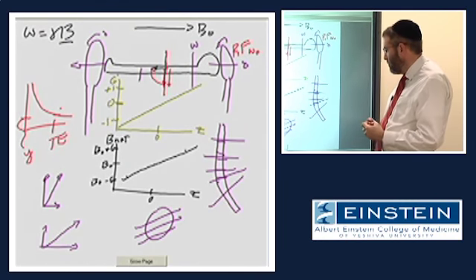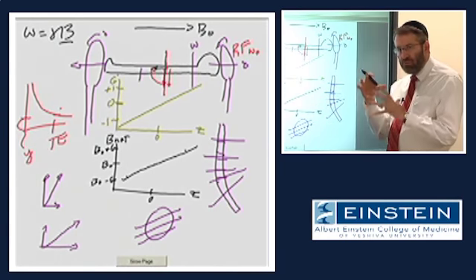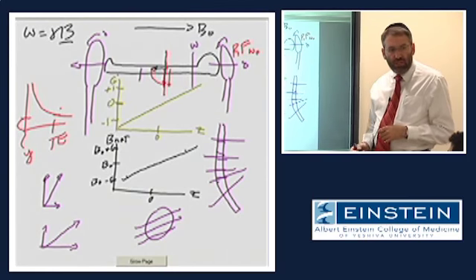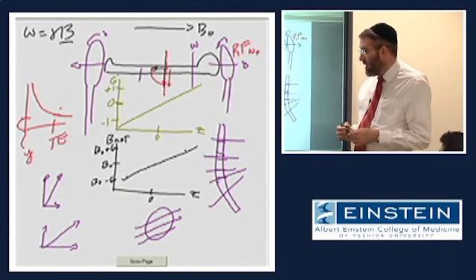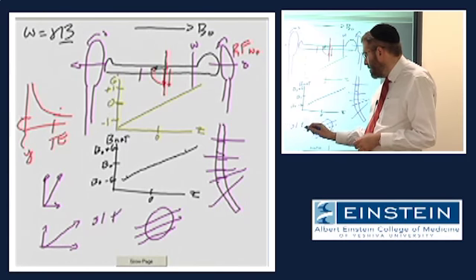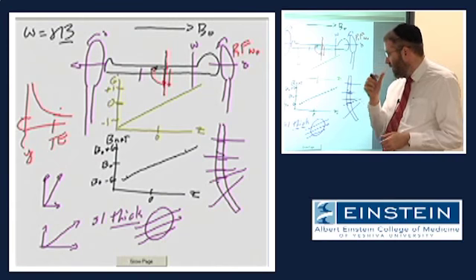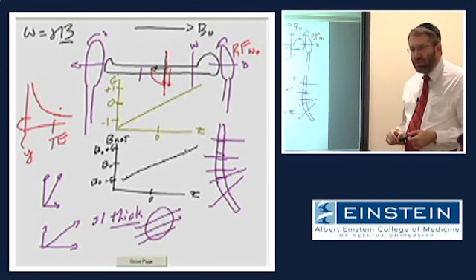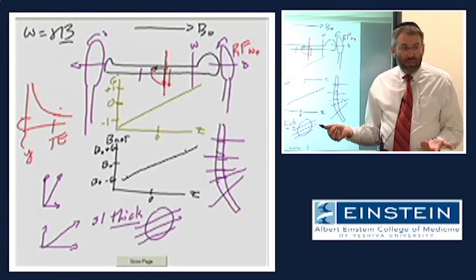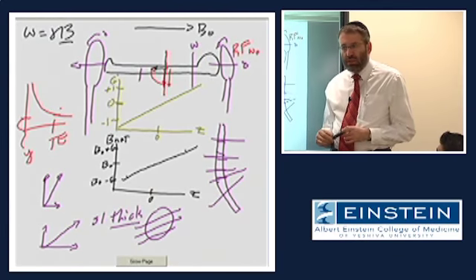Now, in reality, when you sit down and set up your scan, you'll have to tell the orientation of those slices, how many slices you're going to have, and you'll also have to say something about the slice thickness. So how is it that we can modulate the thickness of the slice? In this example, is this a 1 millimeter thick slice? Is it a 10 millimeter thick slice? Somewhere in between? More or less? How do you do that?